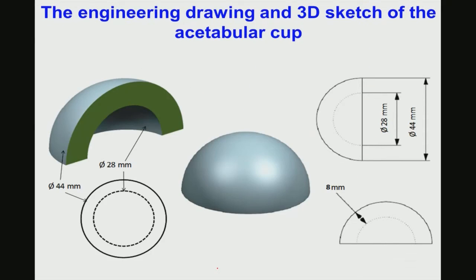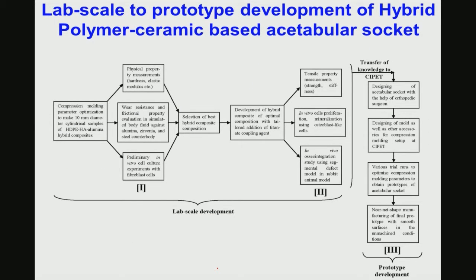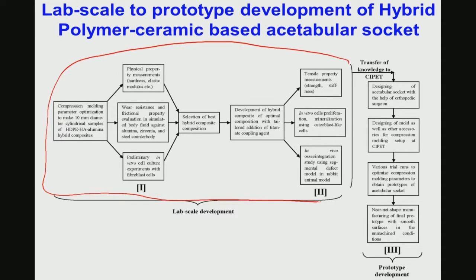Now, just to give a snapshot of what I have shown in this slide: first is the lab scale development, which I have already described. The next step is prototype development. The first thing is the designing of the acetabular socket, then designing of the mold, and then various trial runs to get this compression molding, and then you can do this near net shape manufacturing.